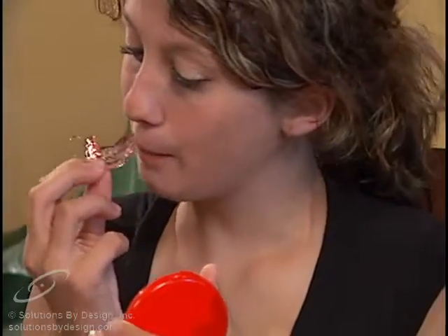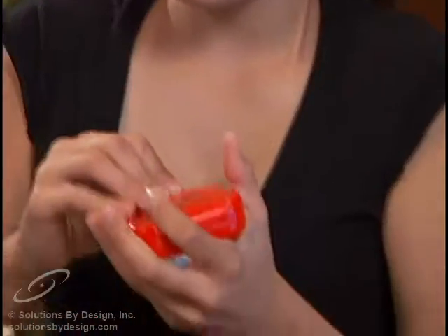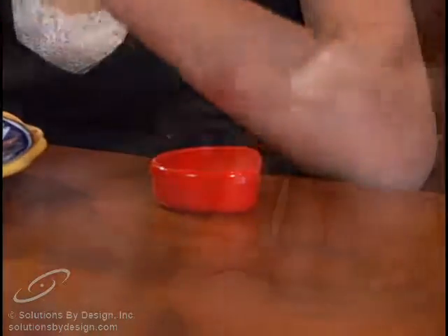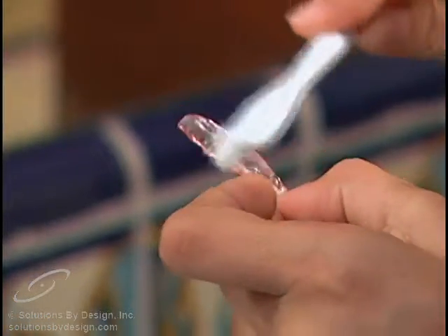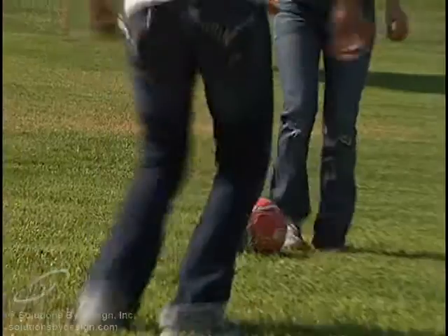Since retainers are removable, their use and care is entirely dependent upon you, the patient. Strict attention to instructions is absolutely necessary. Your retainer should be worn at all times except when eating, brushing, participating in contact sports, or swimming.